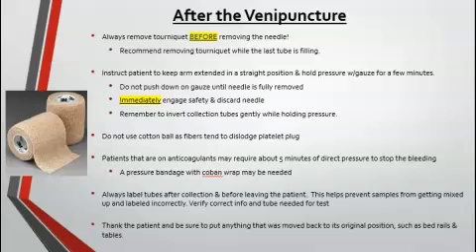Make sure that you always label your tubes after collection and before leaving the patient's room. This is very important in preventing samples from getting mixed up or from them getting labeled incorrectly. You always want to verify that the information is correct and that you've collected the correct tube for the test.